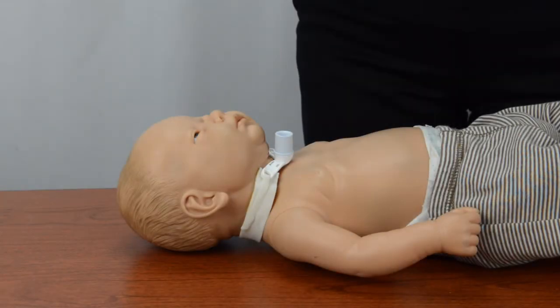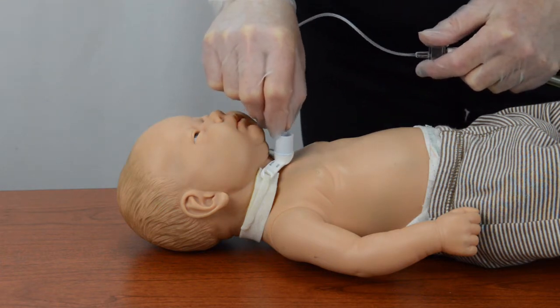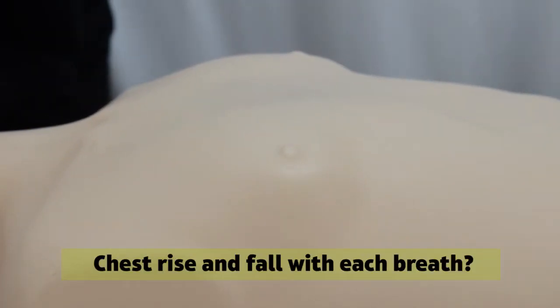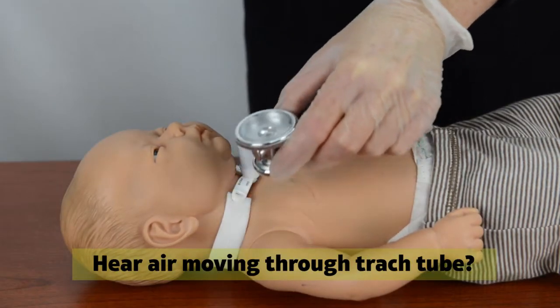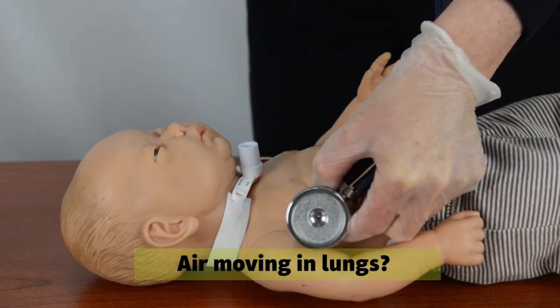If the patient has difficulty breathing, the most usual cause is a blocked trach tube. Suction the trach tube to the identified safe suction depth. After suctioning, look at the patient's breathing. Does the chest rise and fall with each breath? Can you hear air moving through the trach tube? Do you hear air moving in the lungs on both sides of the chest?